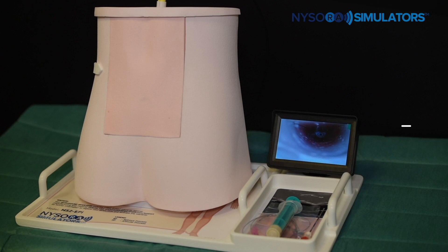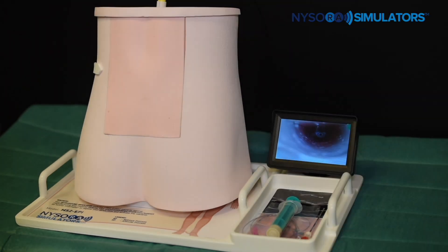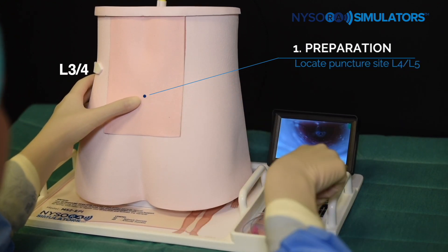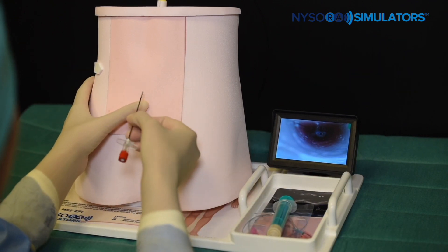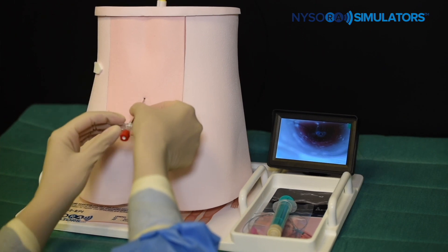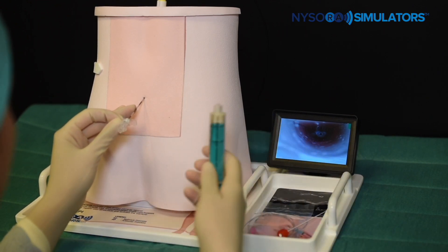Let's see how we can use the Nysora simulator to perform a landmark-based technique. Here we can see an L3 and L4 interspace. Note that although the Nysora simulator physically appears smaller than the human body, the actual anatomical landmarks of importance are exactly the same as in an average-sized adult of 75 kg. The smaller flanks are specifically engineered to allow for ease of storage and transportation.